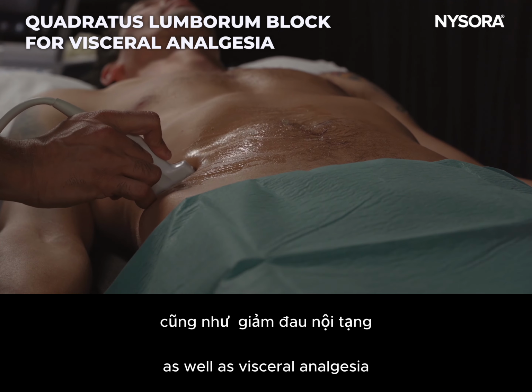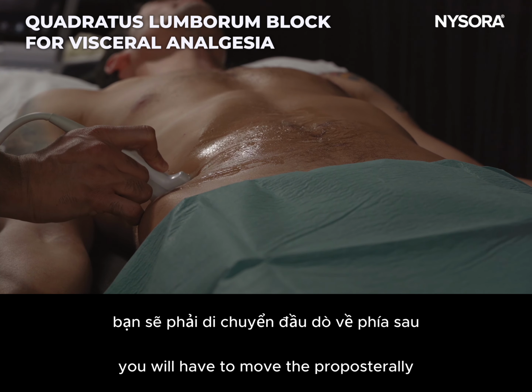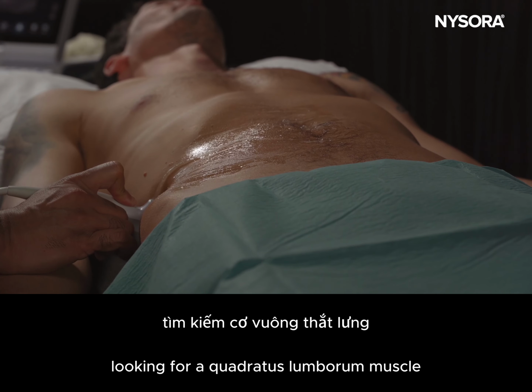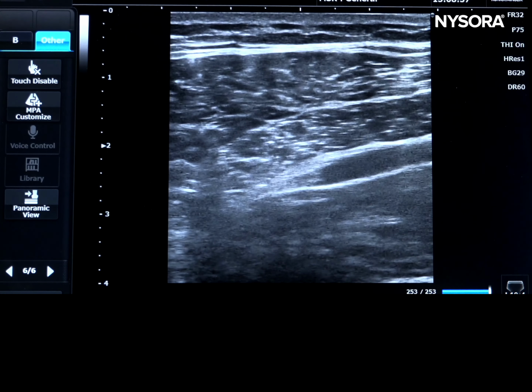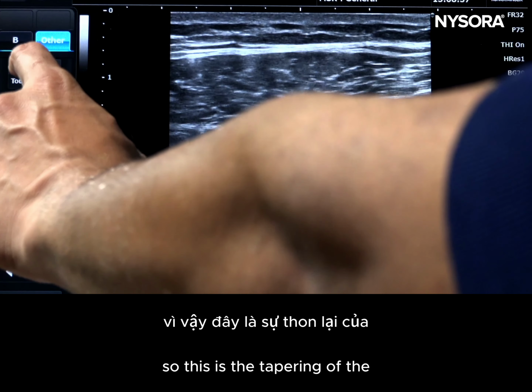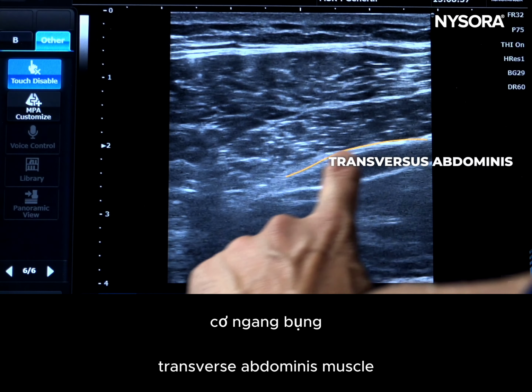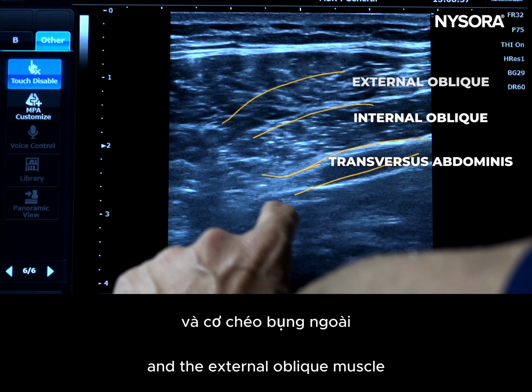To get the benefit of both somatic as well as visceral analgesia, you will have to move the probe posteriorly, looking for the quadratus lumborum muscle, where all these muscles start to taper. So this is a tapering of the transverse abdominis muscle, and you have the internal oblique muscle and the external oblique muscle.